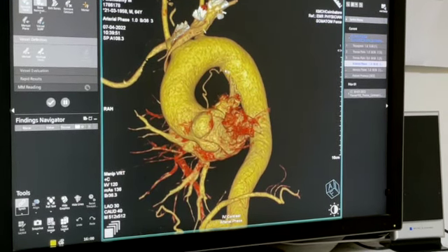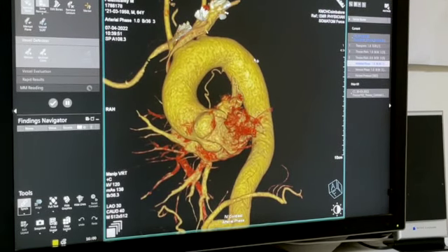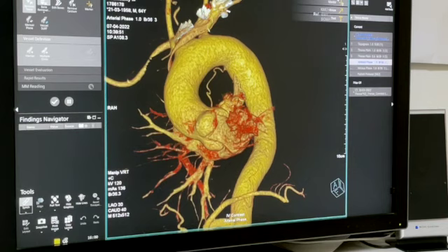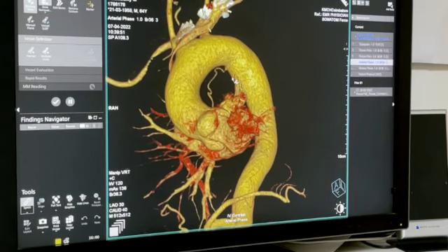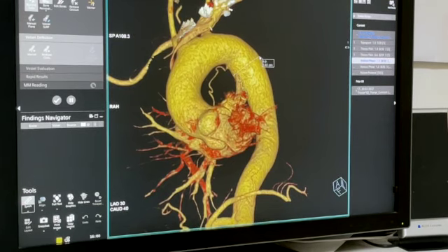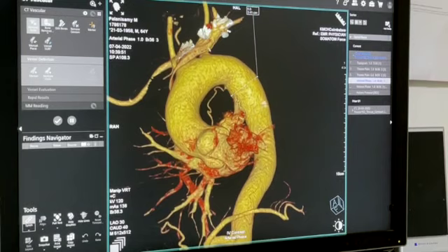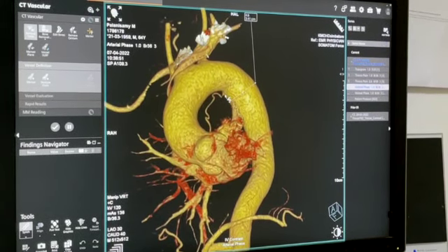If you look at this, you realize hardly any catheter will sit over here. It's a very, very wide aorta. I'll measure that to show you how wide it is. Now this is the aorta, which is going to be like 3.4 centimeters. So the classical cobras won't go. A C3 may hook, but may not be a stable position.